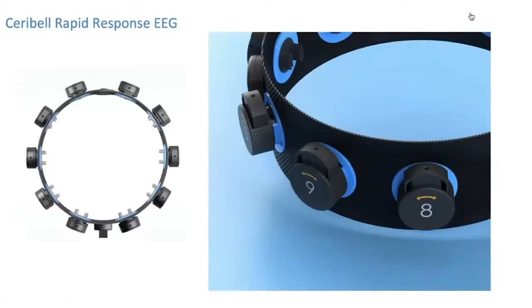It's a little bit of gel that allows the connection to be made, and this gel has to make a good attachment to the skin, which also requires some cleaning of the skin. So the setup allows for some debridement of the superficial layer, which is usually done with a separate device by a technologist, and then placement of gel and an electrode across this. By closing the circuit and including the skin with the recording wire, it's the entire EEG, one has a way of sampling the electrical field around the scalp. Can we go to the next slide?